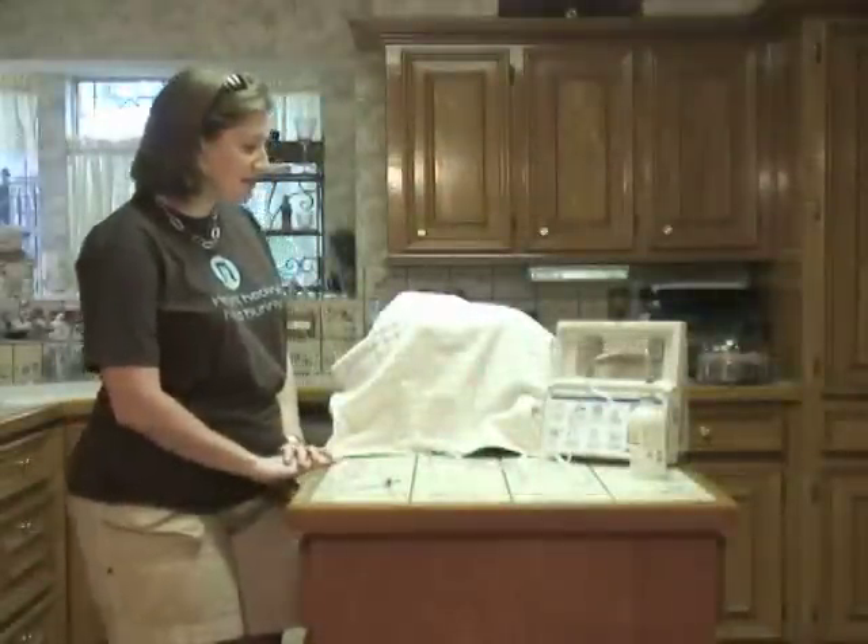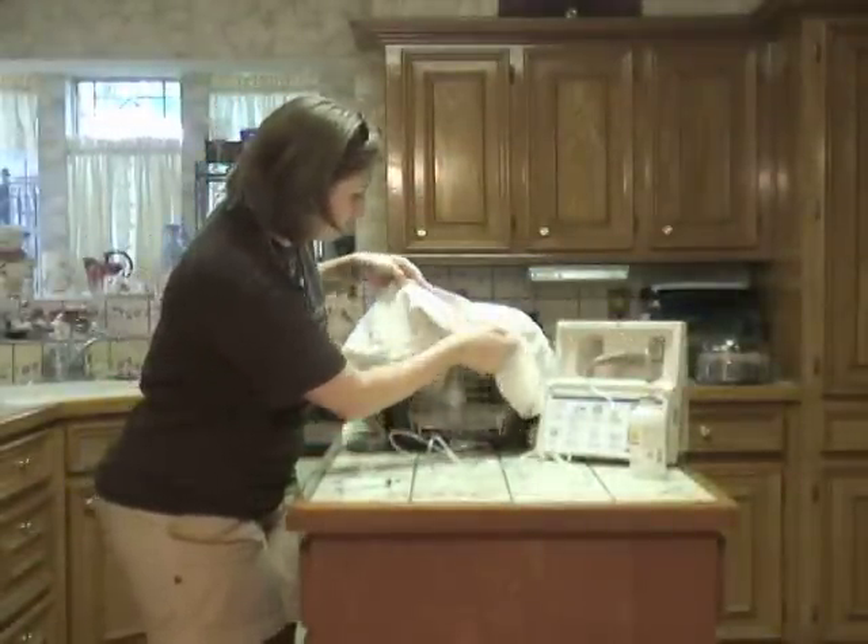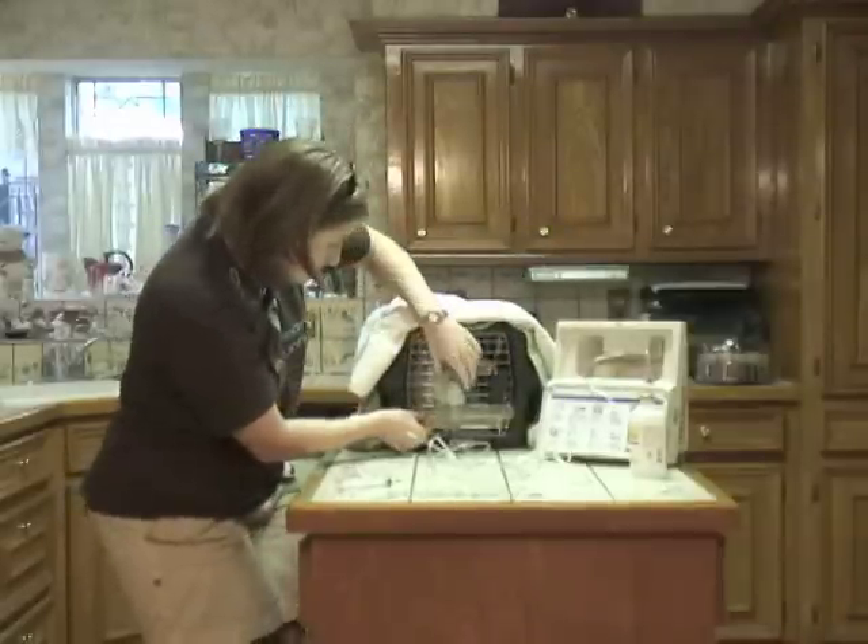About 15 minutes later, if you go ahead and turn it off, our cup is fairly well empty now.